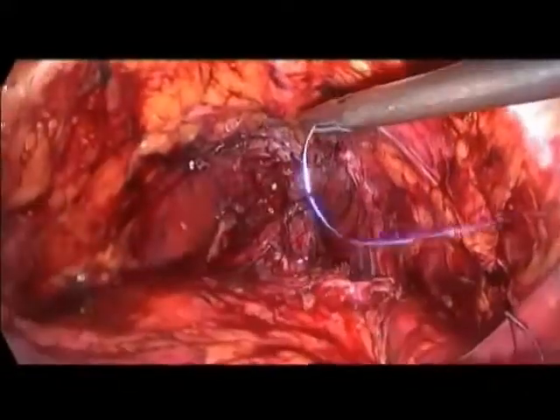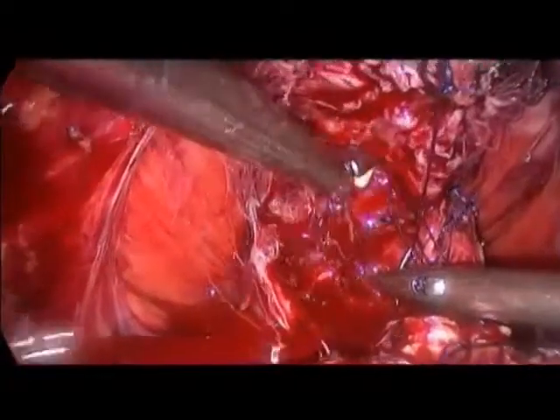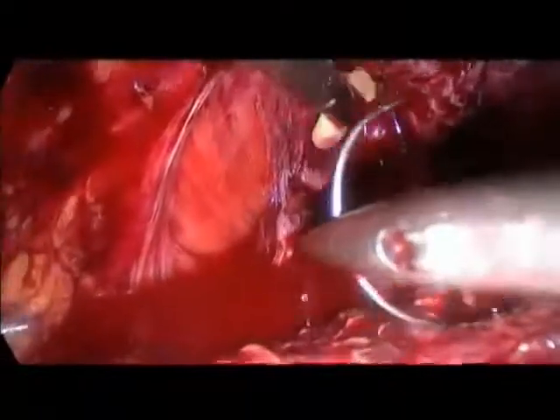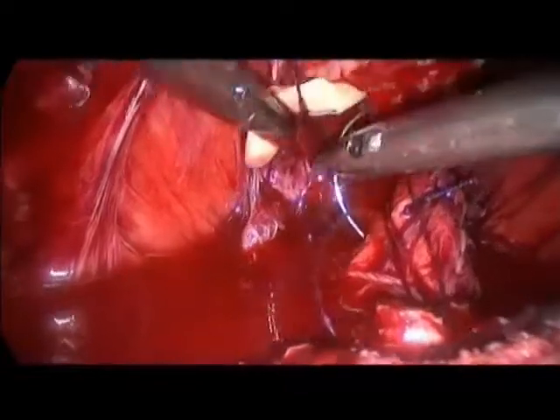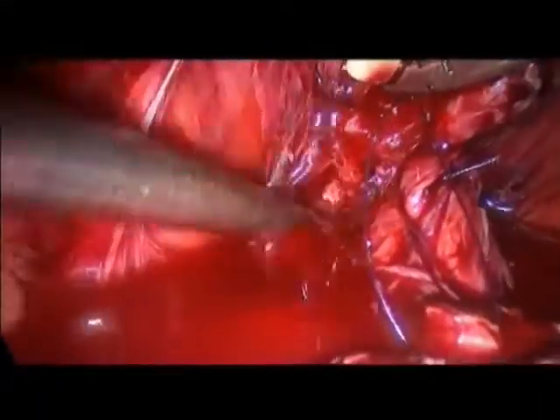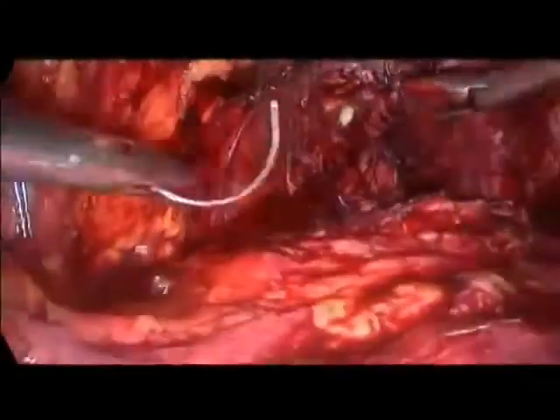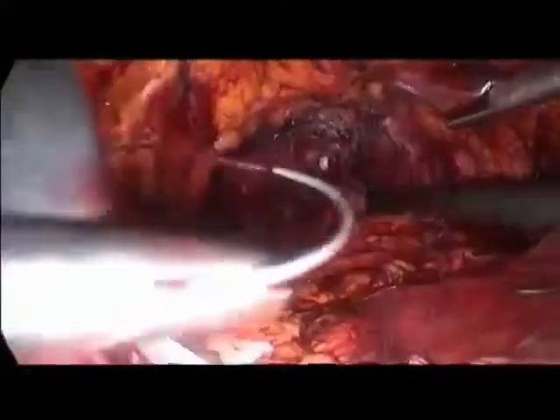So we have achieved three catches on the bladder side on the right and two on the urethral side, as you have seen, so that traction will be exerted on the bladder and not on the urethra. And we are now completing the same approach on the left side at 7 o'clock, keeping in mind to stay lateral to the former catch in order to avoid making knots unwillingly.